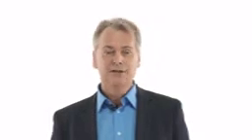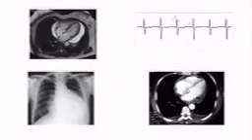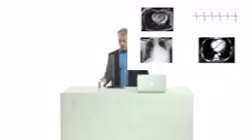But all of these methods have a few pitfalls. Either they're very expensive or not readily available, as for example CT or MRI, or they're rather inexact, as for example the chest X-ray, which is only able to detect rather large fluids, or the ECG, which is very unspecific as well. So the best choice definitely that you have is echocardiography.